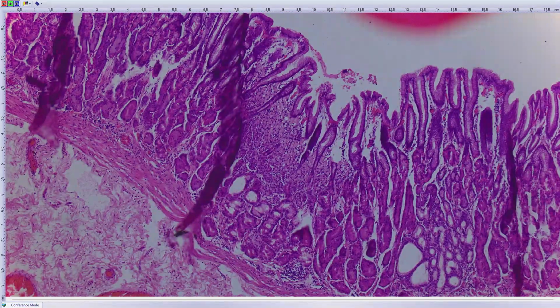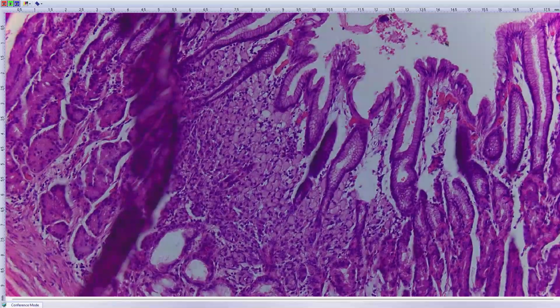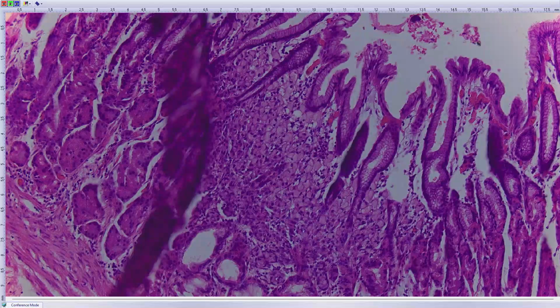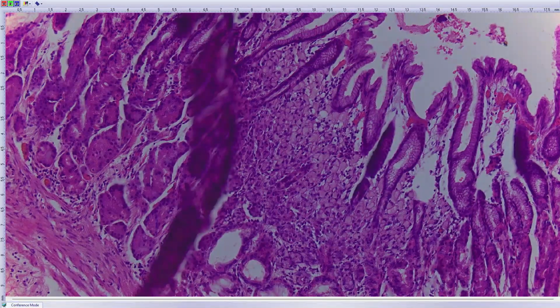This is the biggest focus of the cancer I have found. You see it occupies almost one half of the lamina propria, and in contrast to cancers in, let's say, the colon, even intramucosal cancers in the stomach may metastasize because they have already access to small lymphatic channels. And fortunately for this patient, the resection margins are clear of the cancer, and all examined lymph nodes, 10 or 11, were negative for malignancy.